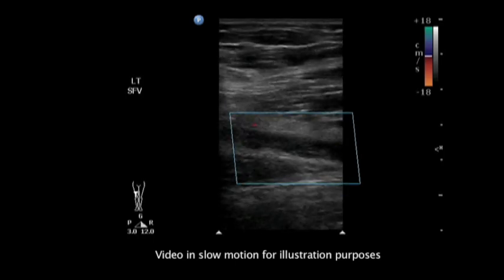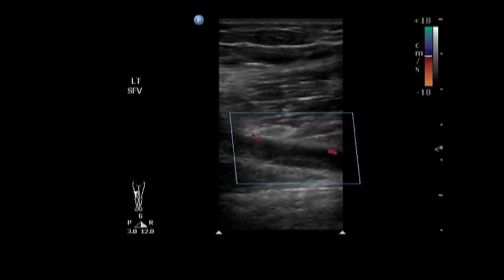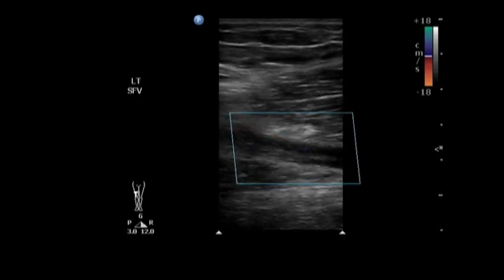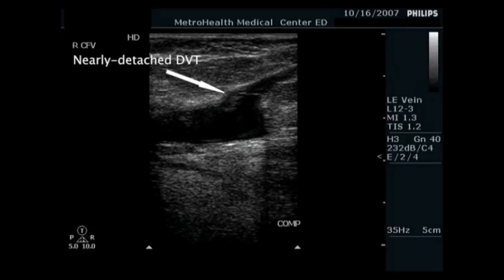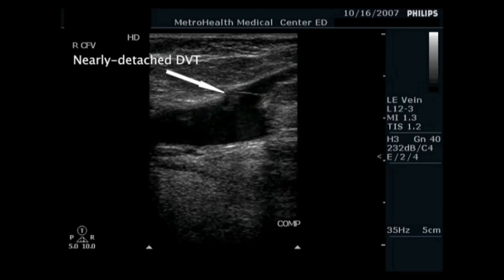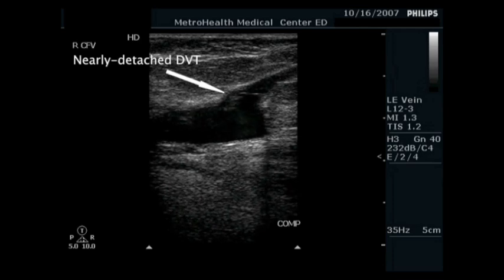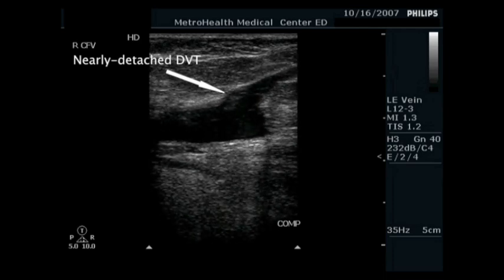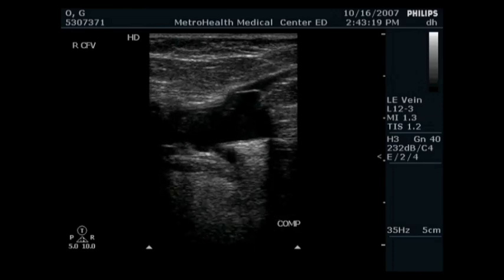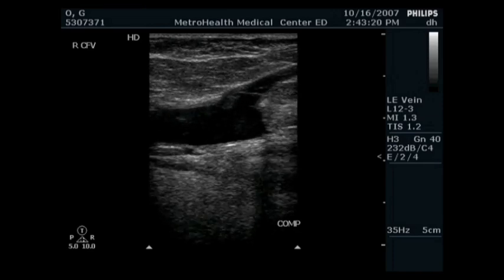Failure of the vein to completely collapse indicates the presence of a DVT, whether acute or chronic, and the treatment remains the same. Caution should be exercised when having found a DVT. Compression should be used judiciously in order to prevent part or all of the thrombus from being dislodged and propelled proximally into the cardiopulmonary circuit.